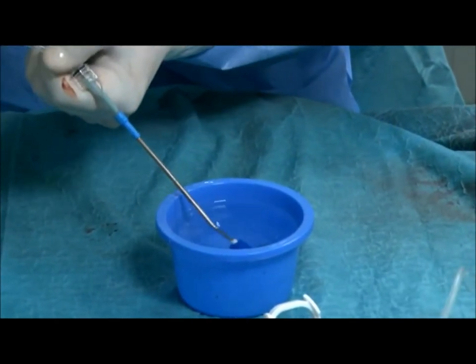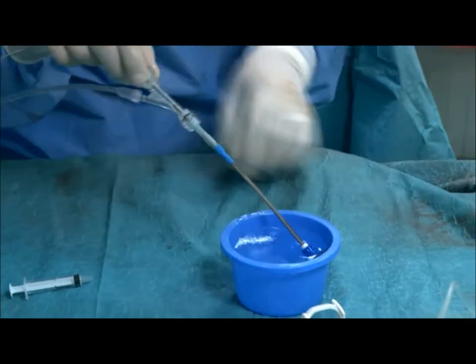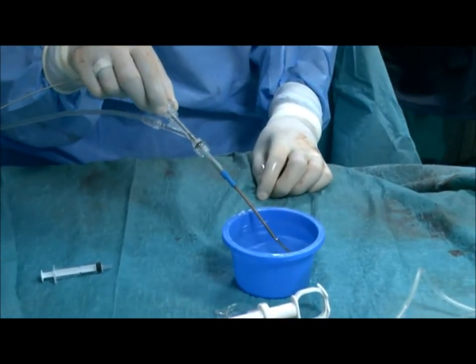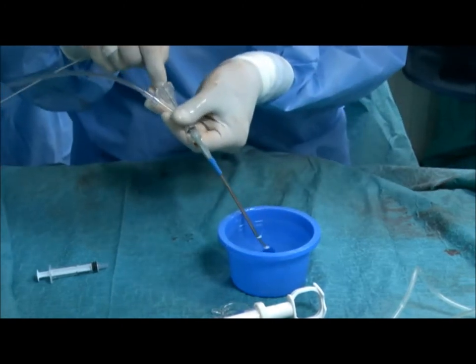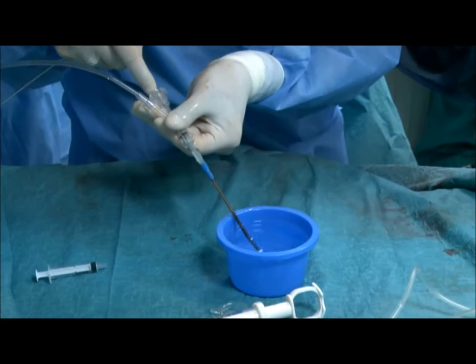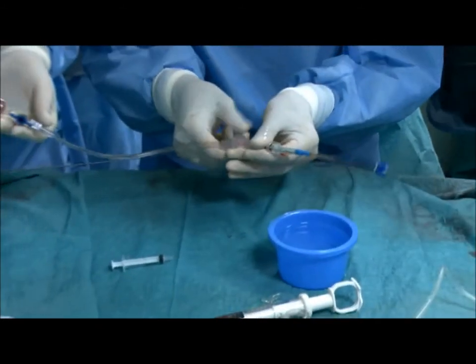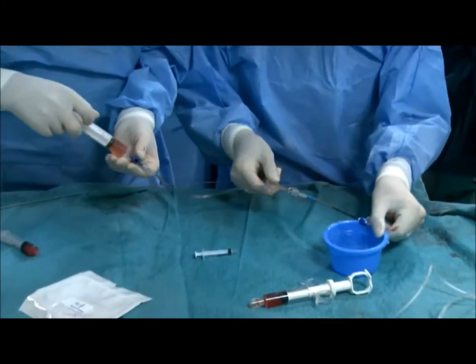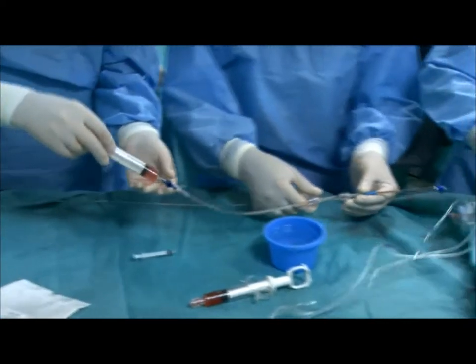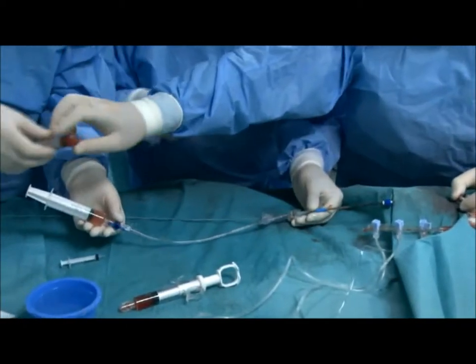There is a comment from the audience. They measured the total septum at 30 millimeter, right? All right, so then the device is being loaded into the loader and it's being flushed. Yeah, flush more. Yeah, okay, that's fine. And then Dr. Nazmi is going to introduce the device. We need a flush.